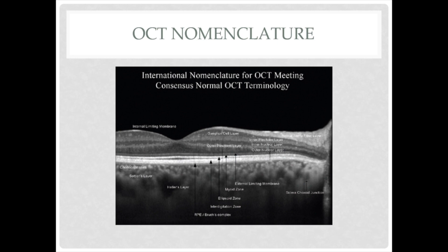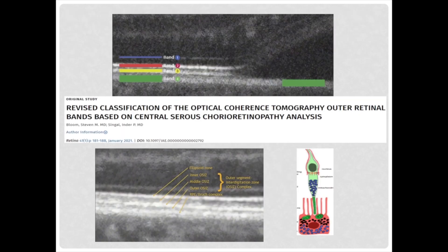Then it is the inner nuclear layer, outer plexiform, outer nuclear layer, and the hyperreflective layer is the external limiting membrane. At the outer retina, there are four hyperreflective layers. They can be called as band 1, 2, 3, and 4.